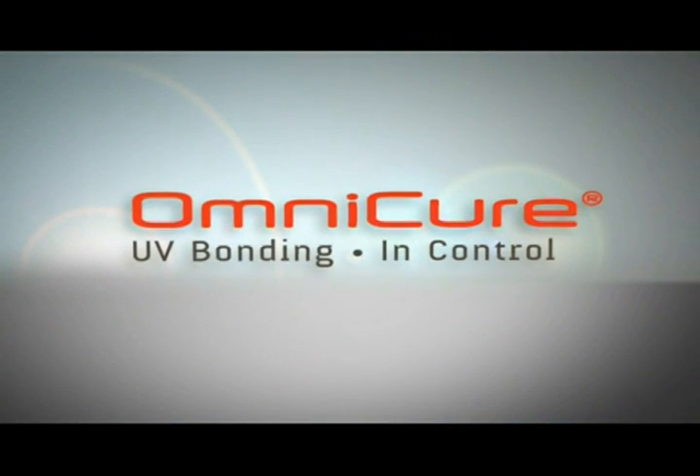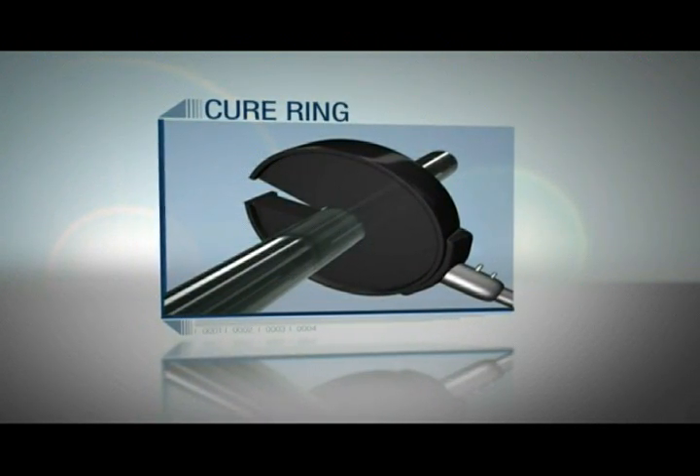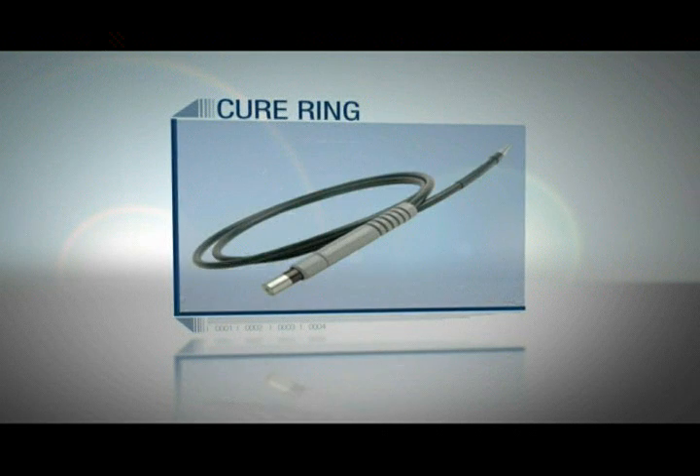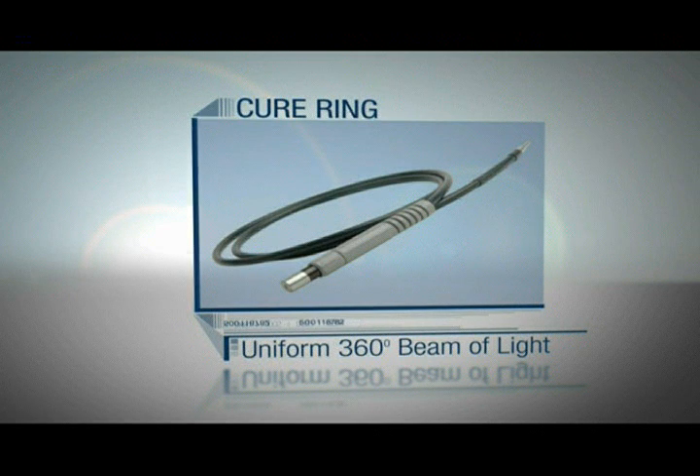Exvo also provides the option of using optical accessories, such as a cure ring for the assembly of balloon catheters. Cure rings attach to the end of standard liquid light guides to provide a uniform 360 degree beam of light.